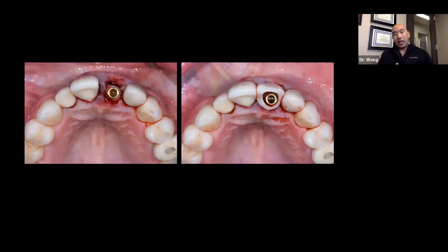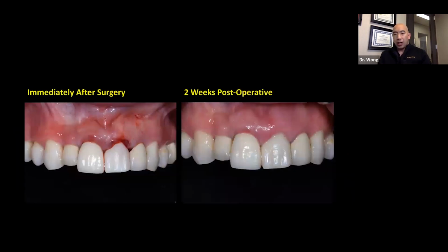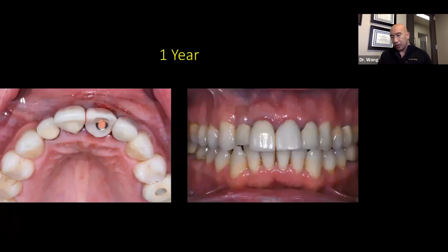So in a situation like this, I would tell you, if you're going to take out a central incisor or any front tooth and put an immediate implant in, it's going to be imperative that you have that CBCT, so that you can prefabricate these temporaries and deliver them to your patient accurately without spending all day in the chair. And if a lab that you work with has access to your digital files and things, they can plan your implant. We're going to go over all this throughout this whole 2-part series to make sure that implant is dead straight and the temporary is fabricated seamlessly and effortlessly for you.